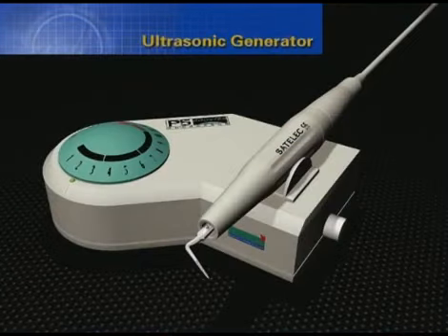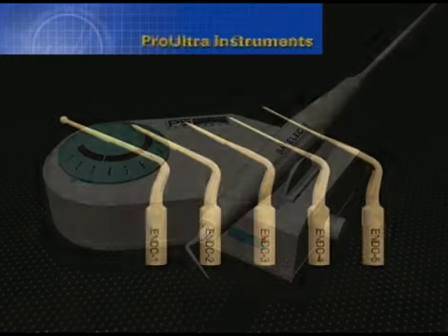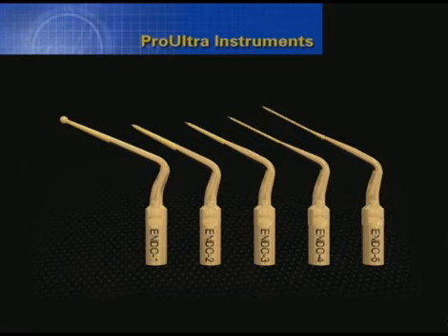The P5 piezoelectric ultrasonic unit provides unmatched power when performing endodontic treatment and retreatment procedures. This unit affords precise working accuracy and a broad power range, and its unique feedback system enhances safety by automatically regulating tip movement. The Pro Ultra Endo 1 through 5 tips are made of stainless steel and then externally coated with a zirconium nitride abrasive. These ultrasonic instruments can be introduced into small spaces while enhancing vision, improving performance, and expanding clinical possibility.